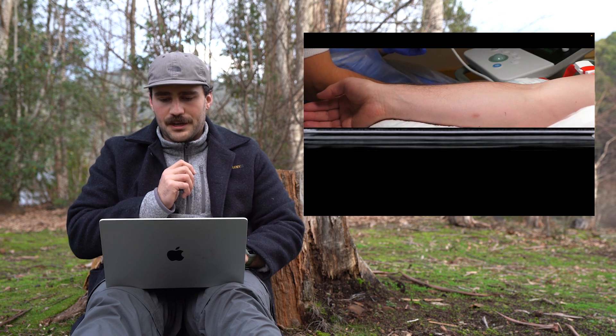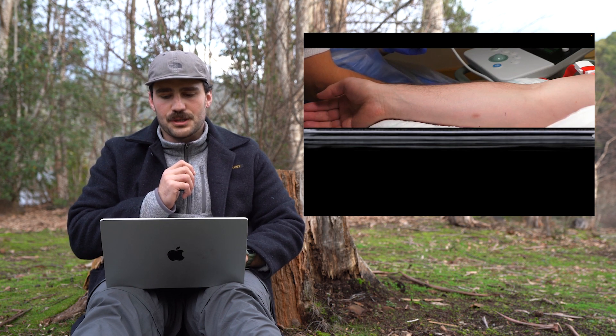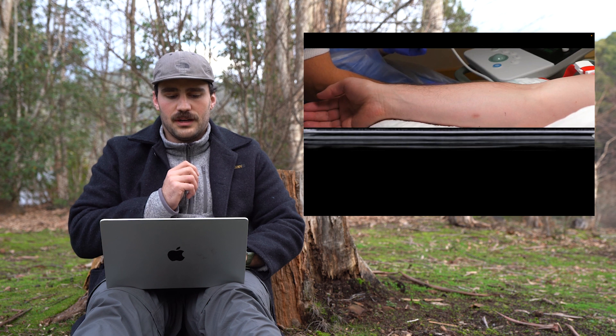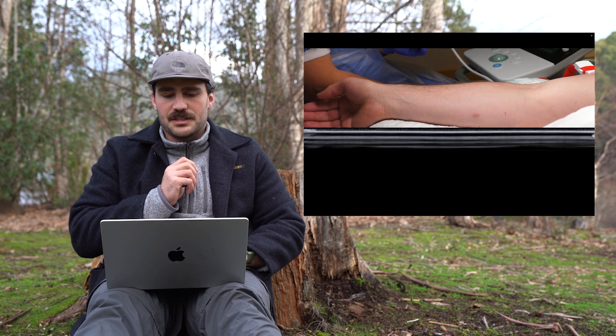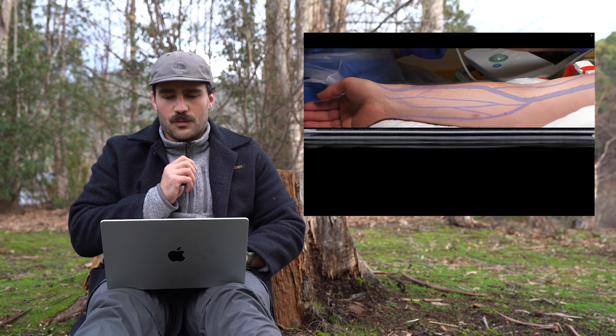We've got a nice view of the patient's arm in a good position. It looks like they've got a little pillow underneath their arm, which is helpful. The ultrasound machine's already set up.